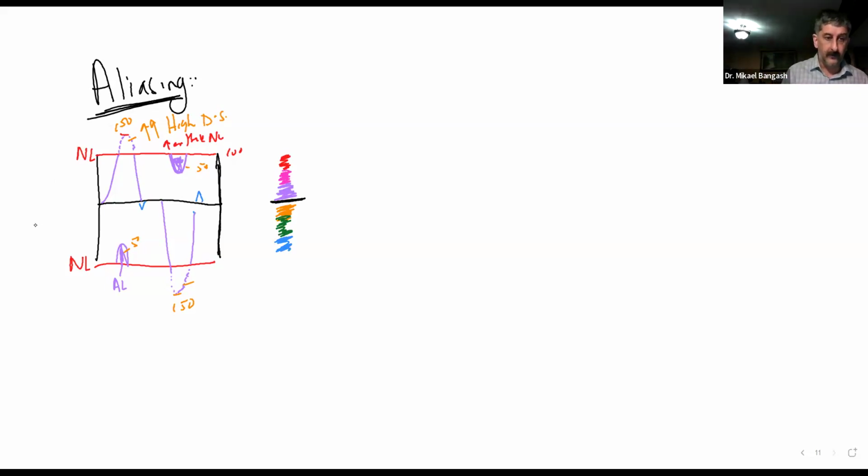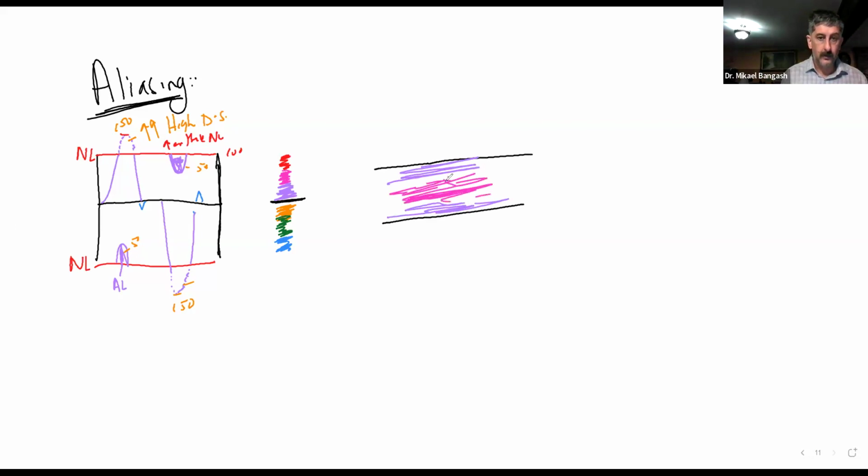Whereas in this case, you could say we had a blood vessel. Now let's say that we have some positive Doppler shift. It's not going to be that well defined, but anyway, that's what we had.